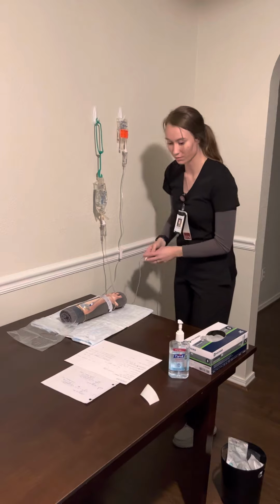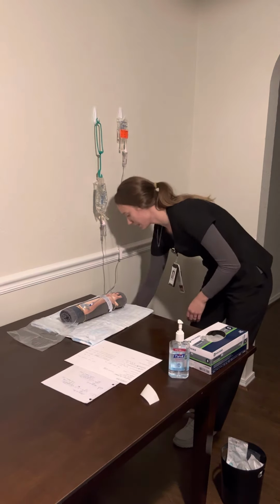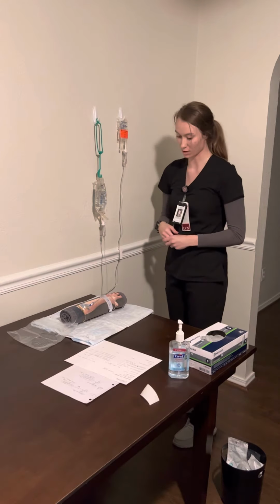That would have been 25 drops per minute. So we're going to leave that running at its rate of 25 drops per minute.